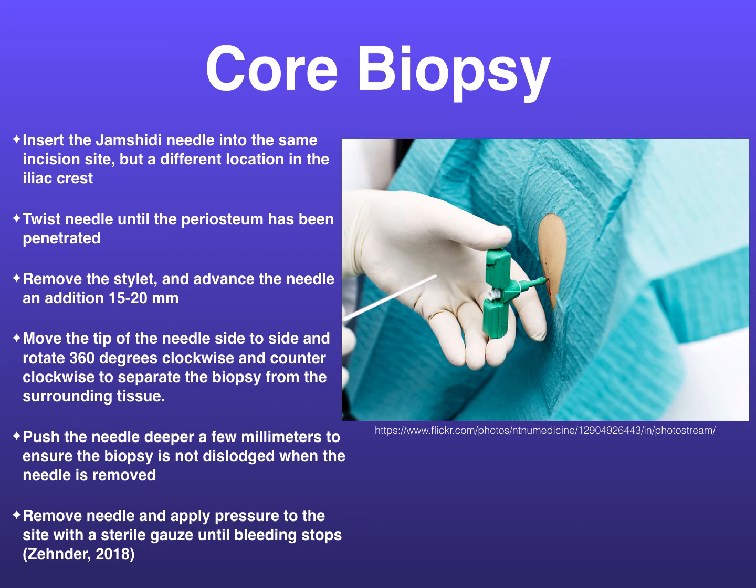Then, before removing the needle, push it in a few millimeters further. This will ensure that the biopsy doesn't slip out of the needle as it's pulled out. Again, apply pressure to the site with the sterile gauze once the needle is removed.